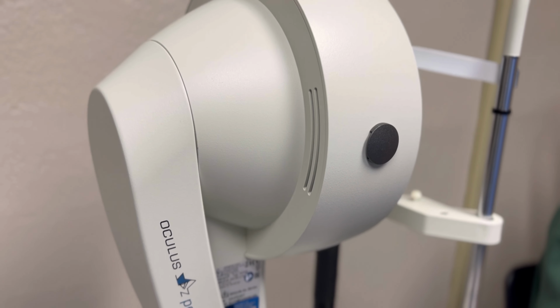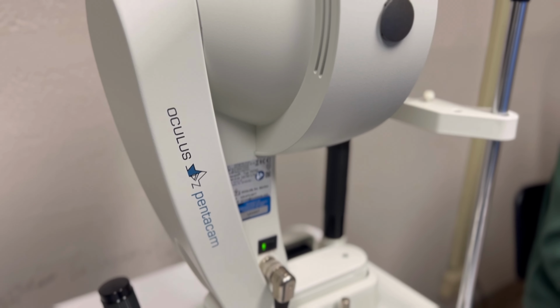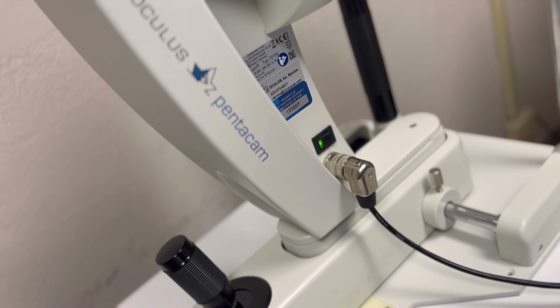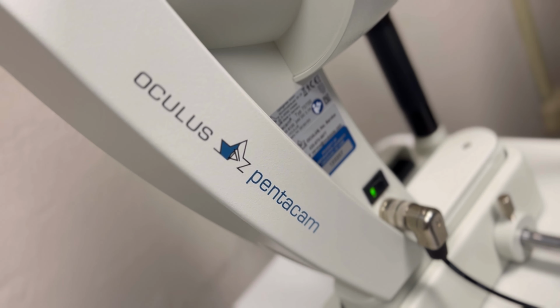The Oculus Pentacam has revolutionized anterior segment imaging and diagnostics. The ability to visualize and measure the posterior float of the cornea is an invaluable resource to us as clinicians. I was recently involved in a patient case where the value of the Pentacam was highlighted.